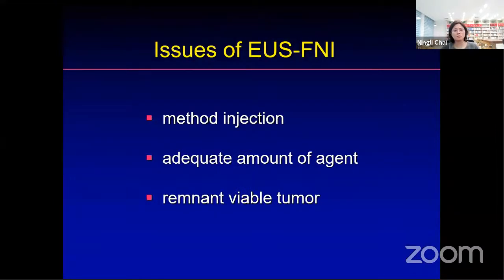These are current issues of EUS-guided ethanol injection. The injection method is not standardized yet, and the amount of ethanol injected is not calculated scientifically. It is more of an empirical treatment. And remnant viable tumor is another issue.